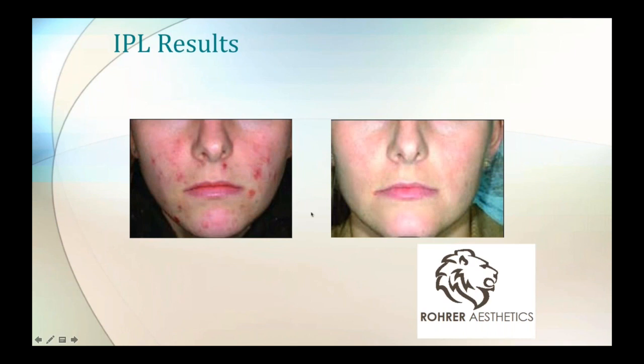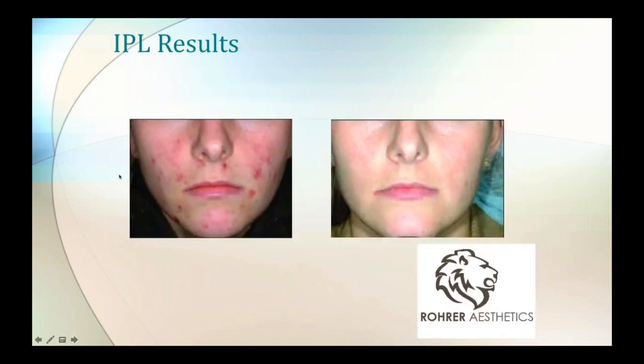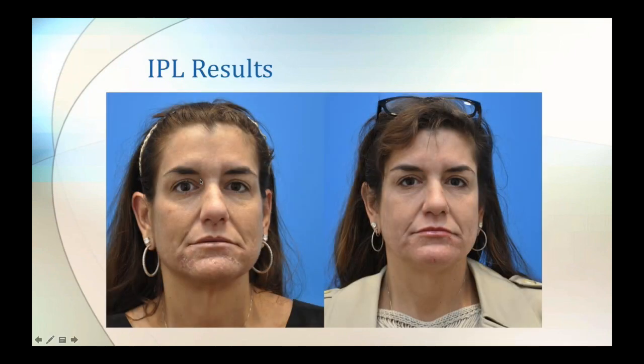Fred, I'm sorry to interrupt. Let me just jump in on that one, because that actually is my patient, and you're correct that we use the red filter, but this is Dr. Beatty, by the way. What we also did with that, and we've had good success with this, is using the 450 nanometer cutoff filter to help improve some of her, not really the cystic acne, but the more run-of-the-mill acne vulgaris. That targets the acne bacteria, and we've had good success in a variety of patients that have had refractory acne, treating in that fashion as well.